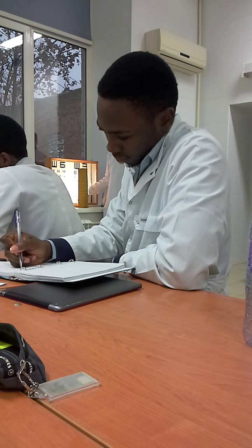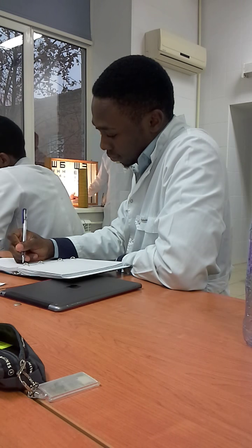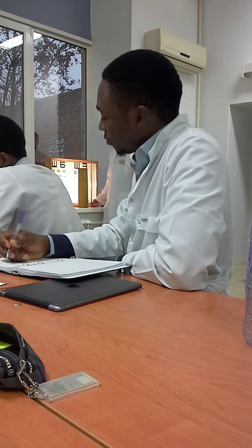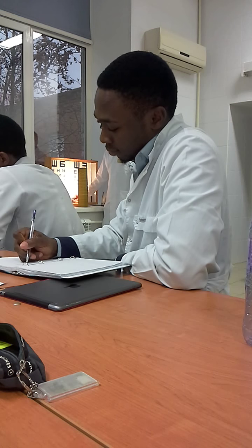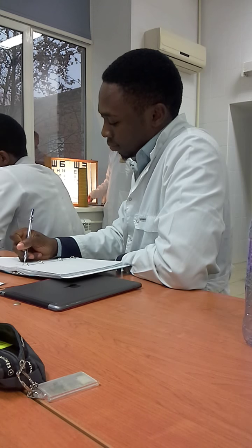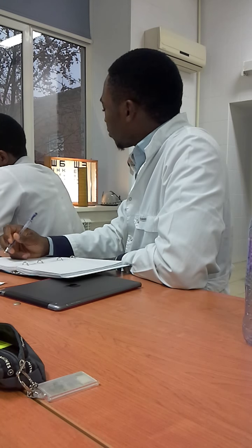Since the ninth line, visual acuity is 0.9. If your patient can read all ten lines, his visual acuity is 1. Minimal normal visual acuity. Visual acuity may be more than 1 — if your patient can read 11 or 12 lines, but that is not so interesting for us as doctors.